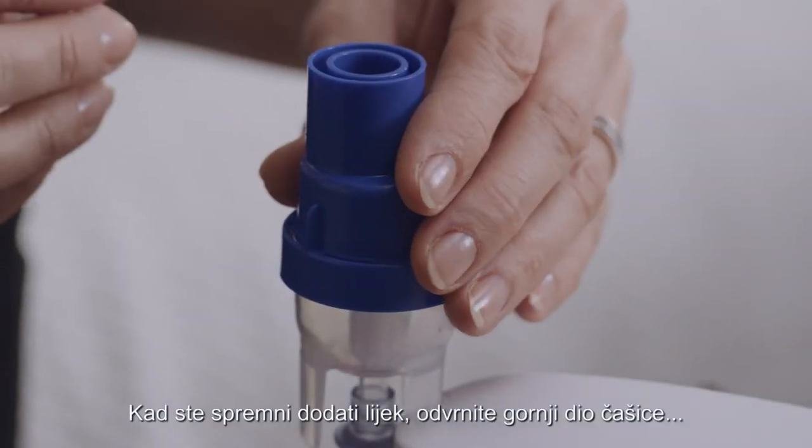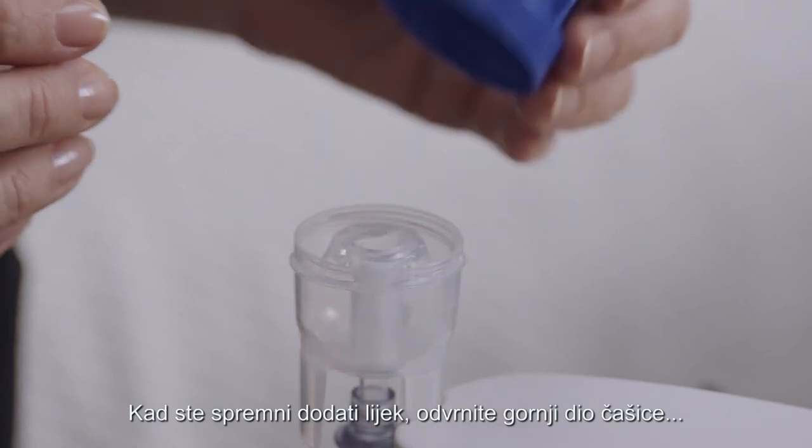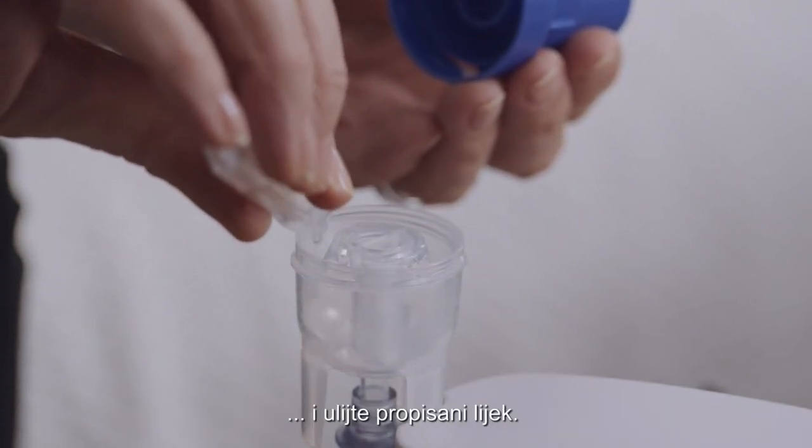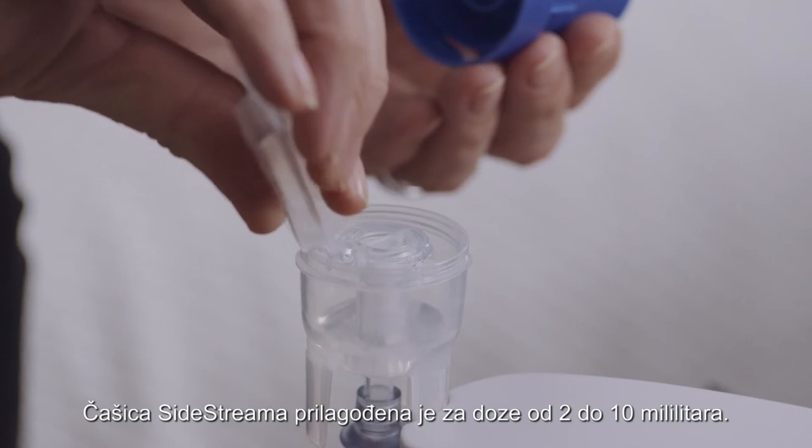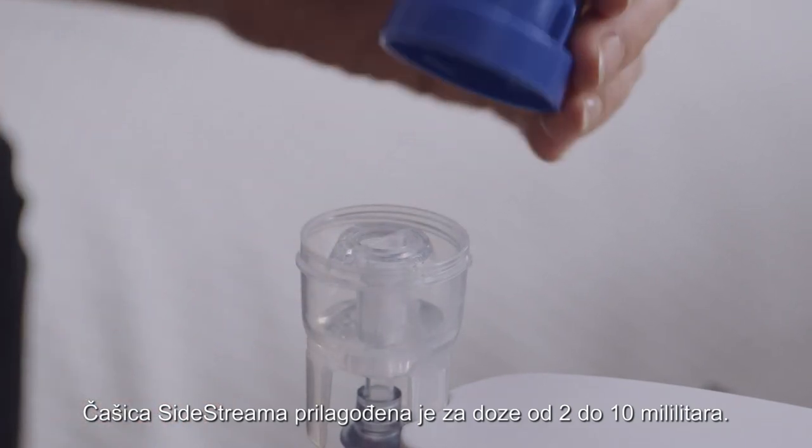When you're ready to add the medication, unscrew the top of the Sidestream Nebuliser cup and pour in the prescribed medication. The Sidestream Nebuliser cup is suitable for 2ml to 10ml doses.